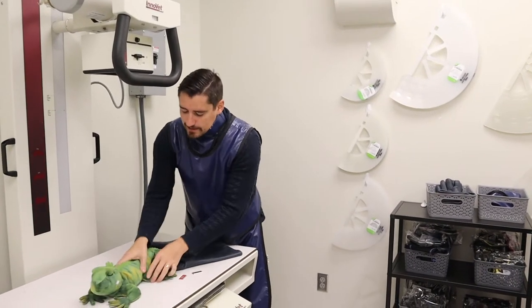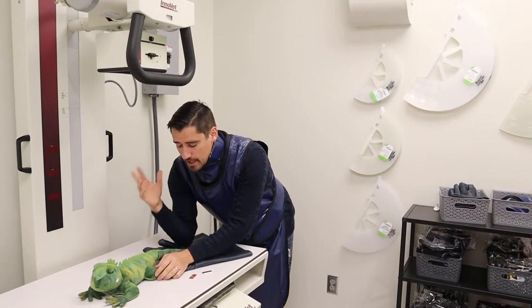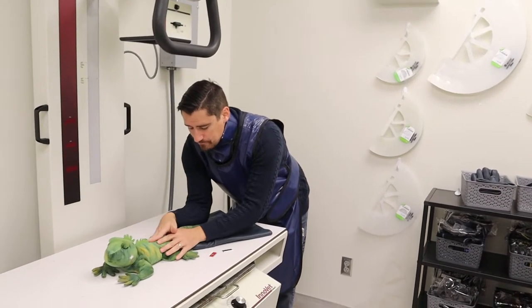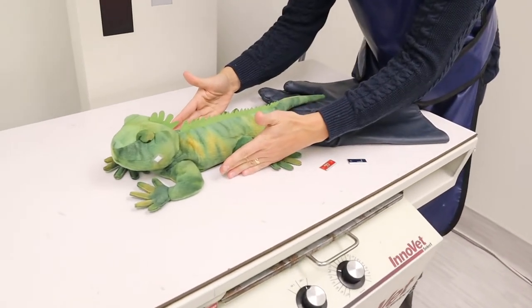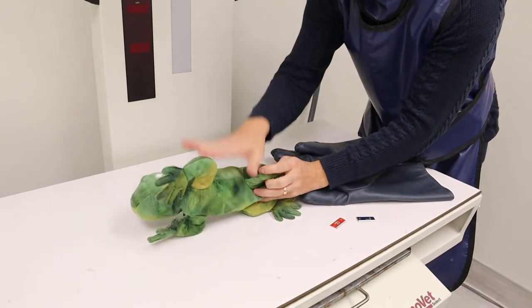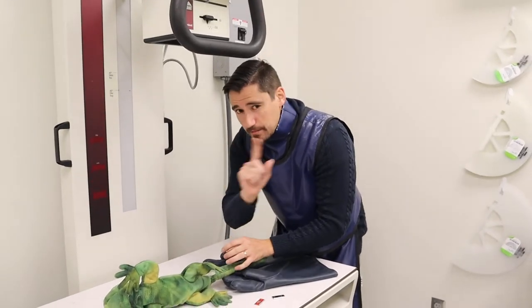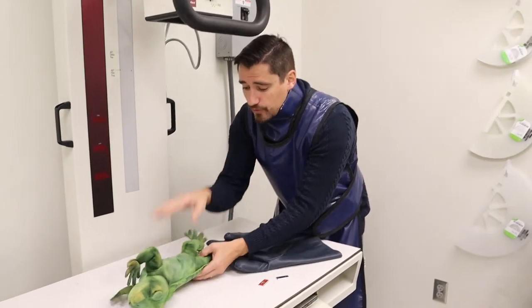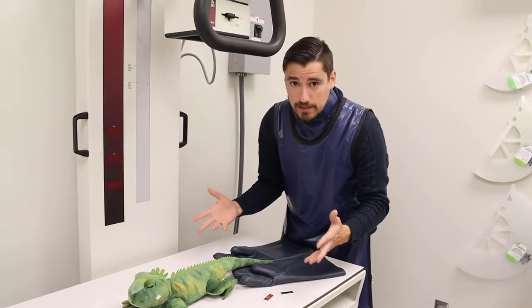Let's say Franklin doesn't feel good. We have to take multiple shots. If you take one shot — say straight down — I get the x-ray, but I could miss where the problem is. So I need to take a shot straight down and a shot on the side, and that allows me to localize where the problem is. Sometimes I'll even take three shots so we're super confident with where the problem is.